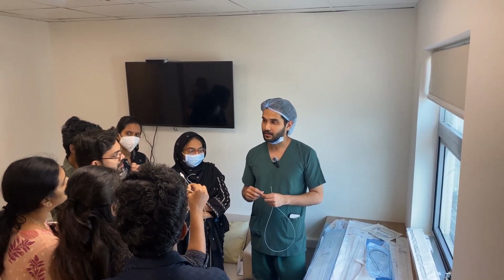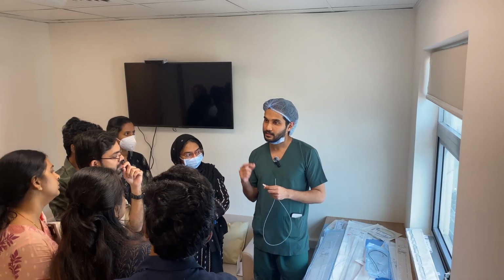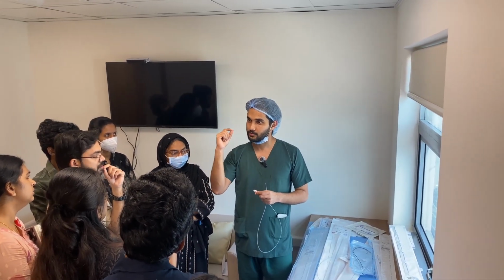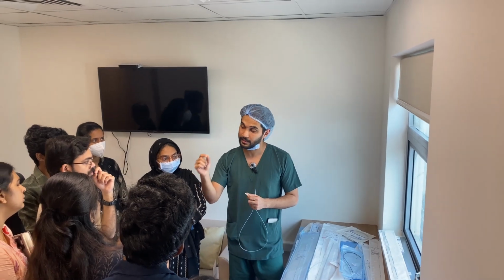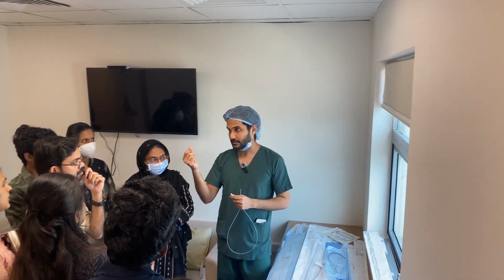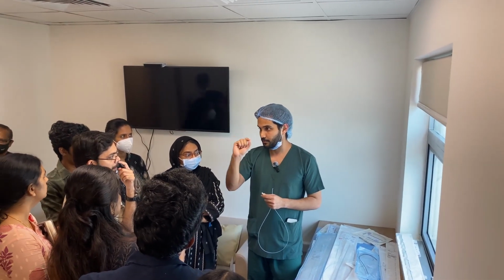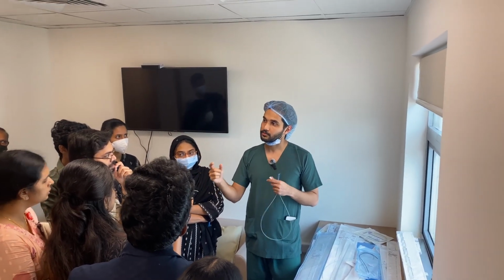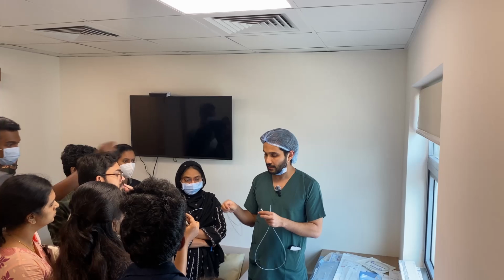അല്ല, അതിന് സ്റ്റെബിലിറ്റി വേണം. നമ്മളൊരു ടെലിസ്കോപ്പിംഗ് ടെക്നിക്കാണ് ഉപയോഗിക്കുക. അതായത് ആദ്യം ഒരു ഷീത്ത് ഉപയോഗിക്കും, പിന്നെ ഒരു ലോങ് ഷീത്ത് ഉപയോഗിക്കും, അതിന് ടെലിസ്കോപ്പ് ചെയ്തിട്ട് വേറെ സ്റ്റേബിൾ ആയിട്ടുള്ള ഒരു കത്തീറ്റർ ഉപയോഗിക്കും. ഈ മൈക്രോ കത്തീറ്റർ അത്ര സ്റ്റേബിൾ അല്ല, അവിടം വരെ എത്തുന്ന സമയത്ത് ഫ്ലോപ്പി ആയി പോകും. അപ്പോൾ ഡിസ്റ്റൽ പാർട്ടിൽ മാത്രം അതിനേക്കാളും നീളമുള്ള ഒരു മൈക്രോ കത്തീറ്റർ ഉപയോഗിച്ചിട്ട് അന്യൂറിസത്തിൽ എത്തണമെങ്കിൽ ഇത് ഗൈഡ് വയർ.